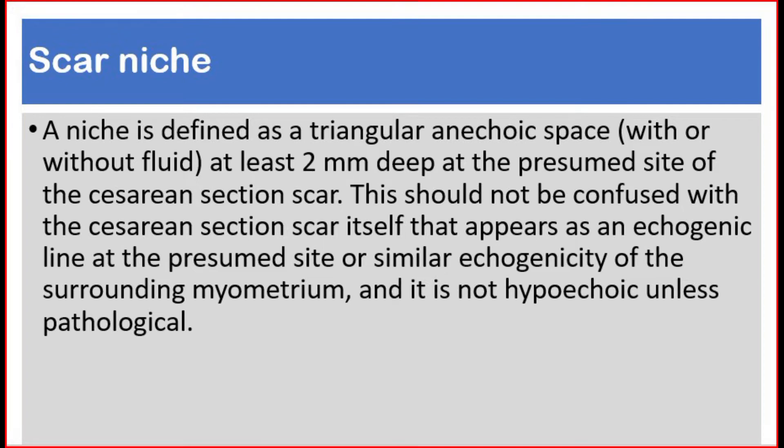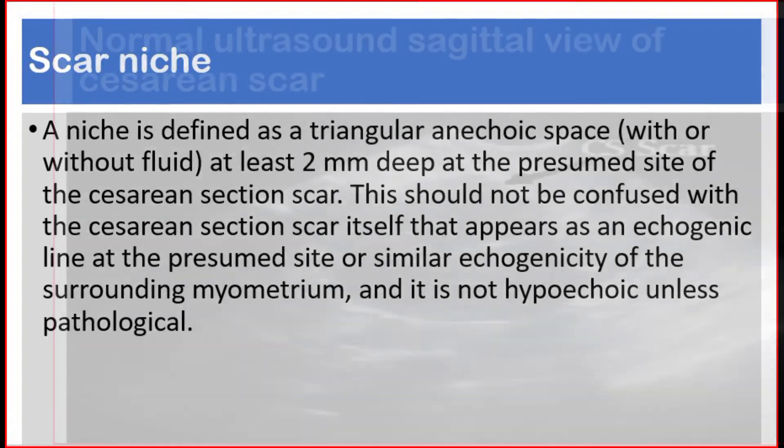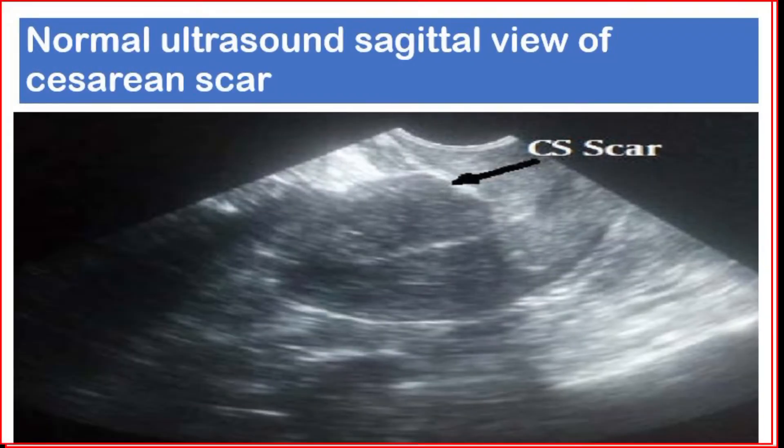A scar niche is defined as a triangular anechoic space with or without fluid, at least two millimeters deep, at the presumed site of the caesarean section scar. This shouldn't be confused with the caesarean section scar itself, which appears as an echogenic line at the presumed site or with similar echogenicity of the surrounding myometrium, and is not hypoechoic unless pathological.